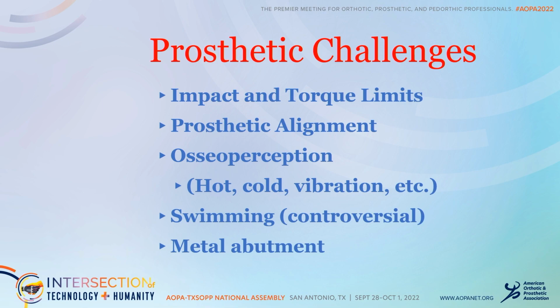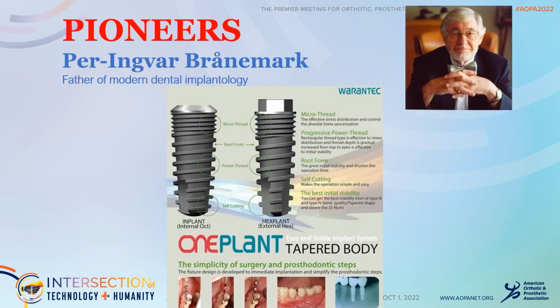Remember we said osseoperception is a cool thing for people? It also is hard for people too, because they may feel more things, they may feel vibration when they're out driving or something like that. There's some controversy about whether a person with osseointegration should go in a swimming pool, specifically swimming pools or stagnant water because of the risk of infection. And the other thing that seems obvious, but there's going to be a piece of metal sticking out of their body for the rest of their lives. And that's something that's different that people have to get used to.